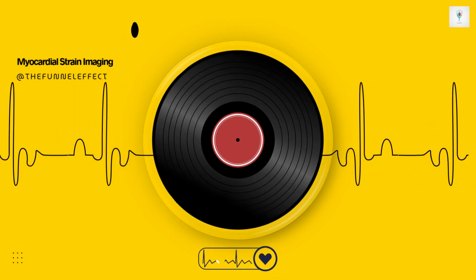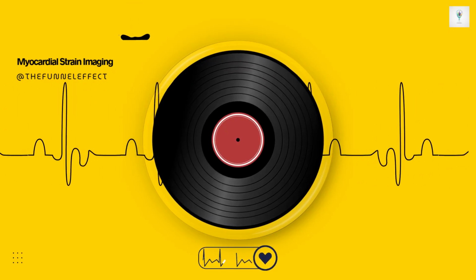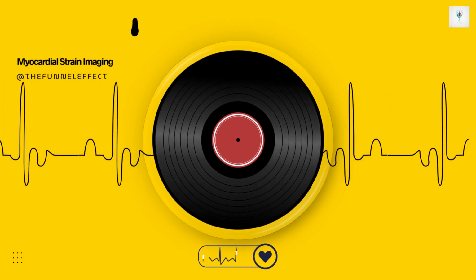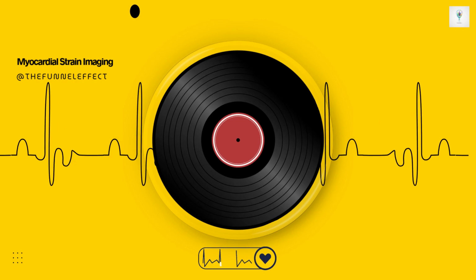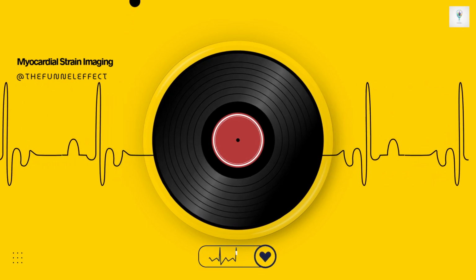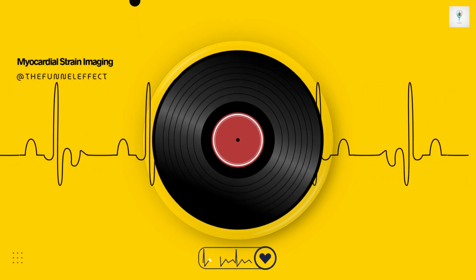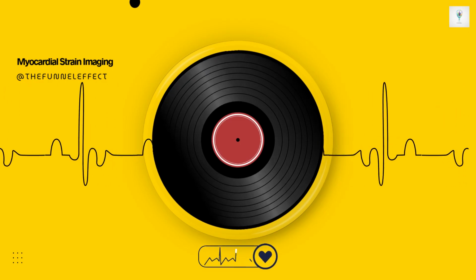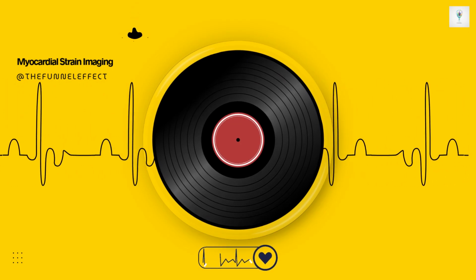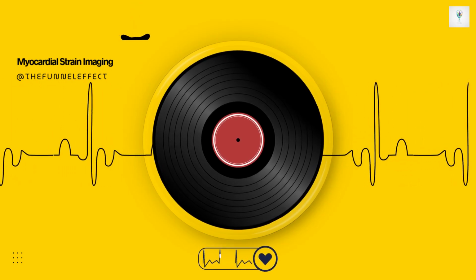Exactly. If the patient has a conduction delay, like a bundle branch block or any other reason for a distorted QRS complex on their ECG, relying solely on that automated ECG timing can be wrong. You might miss the true point of aortic valve closure. So what's the solution? Manual correction. The operator needs to visually confirm the timing of the valve closure events on the echo images themselves, or use Doppler signals, and manually adjust the timing markers in the software if the automated ECG placement is clearly incorrect. If you don't, you risk underestimating the true peak strain.